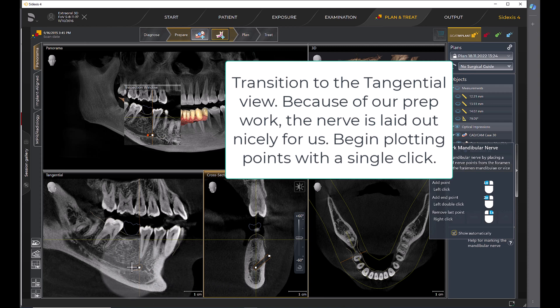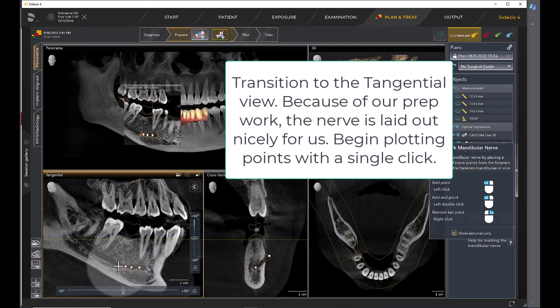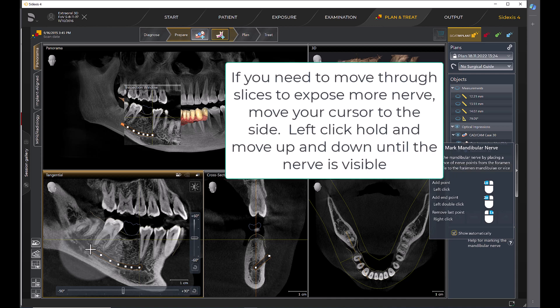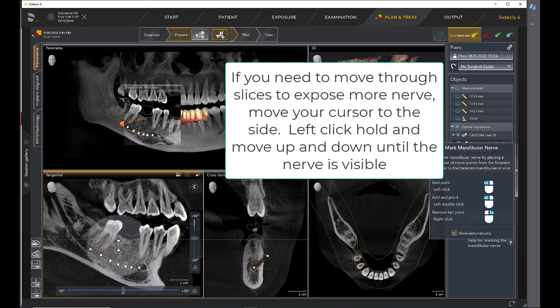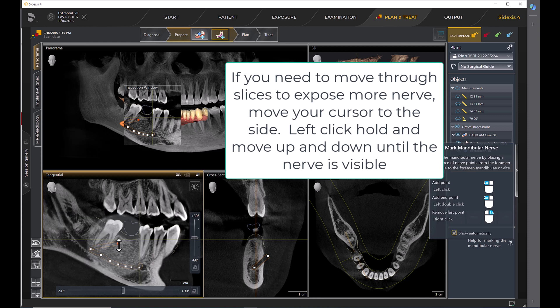Transition to the tangential view. Because of our prep work, the nerve is laid out nicely for us. Begin plotting points with a single click. If you need to move through slices to expose more nerve, move your cursor to the side. Left click hold and move up and down until the nerve is visible.